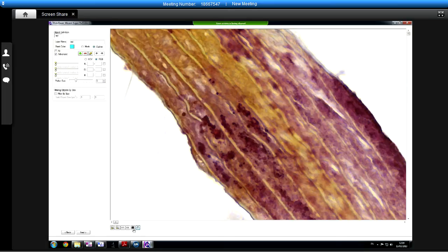Is this something that might benefit from being done in grayscale, where you can select yellows lower? It might benefit from that, but unfortunately you can't do that. It's one of those things, it's either one thing or the other, isn't it? Yeah.